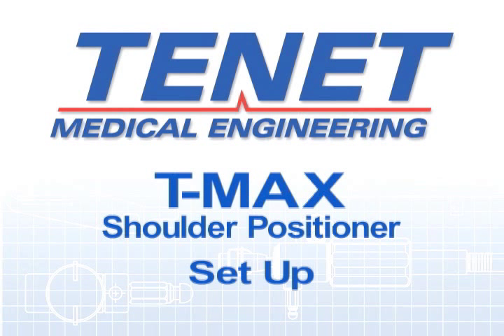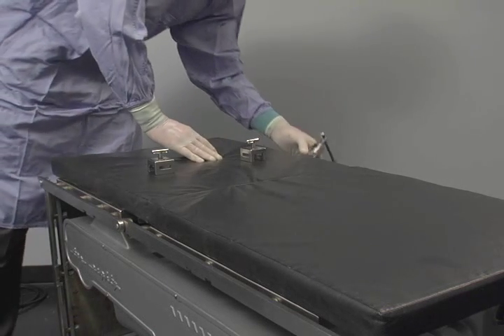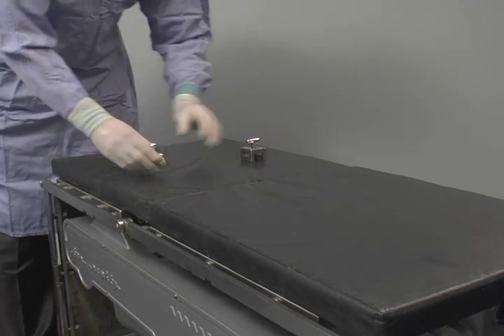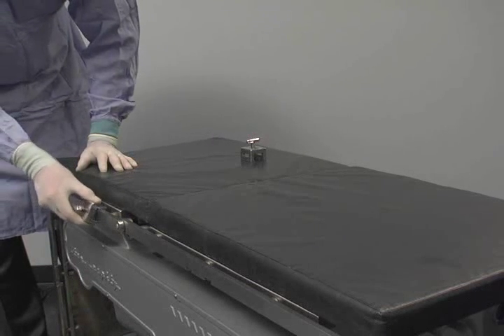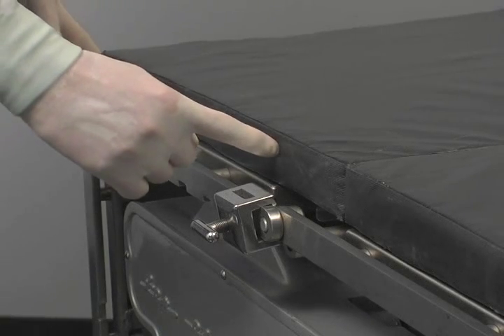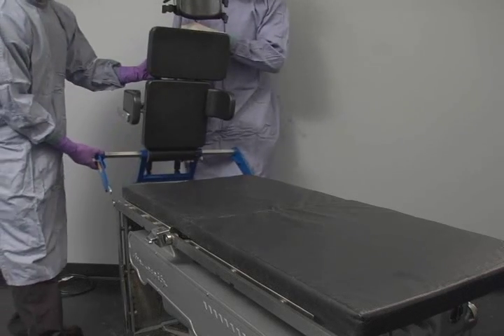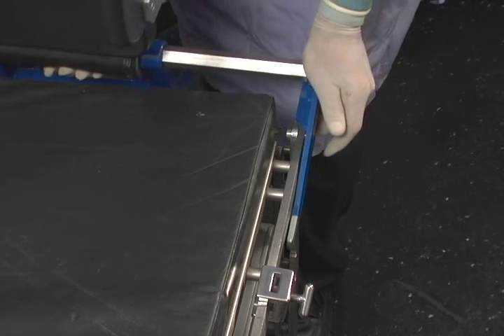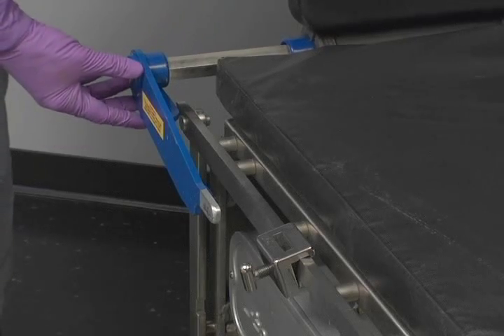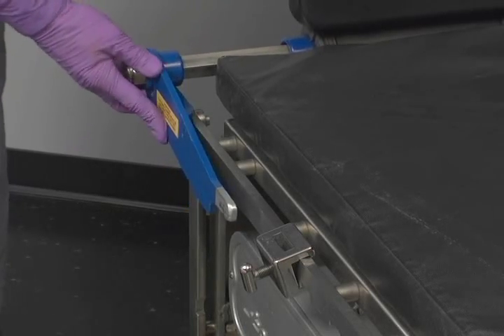The procedure to set up the TMAX on an OR table is fairly simple. Ensure that the OR table legs are locked to the floor. Lower or remove the head or foot section of the OR table. Put a Clark clamp on the non-operative side of the table to place the adjustable arm board into. Then place a square rail clamp on each side of the OR table. Hook the front of the left leg under the rail with the back tab on top of the rail, then slide the left leg flush against the OR rail.